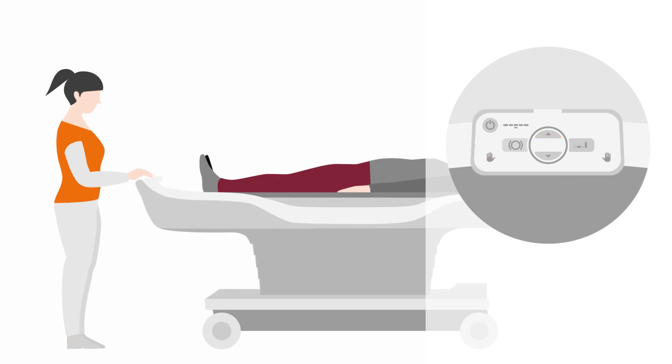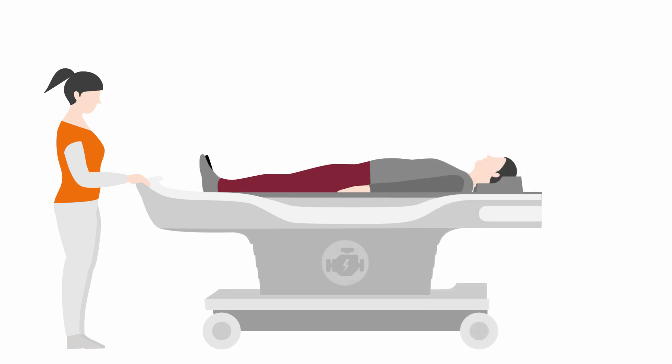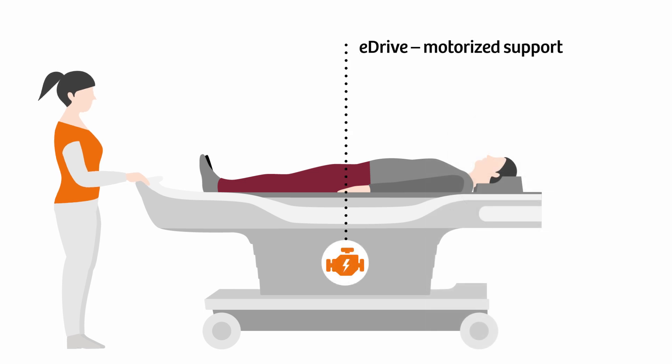The table is sensitive to the user's touch and activates the eDrive motor support as soon as both hands are positioned on the handle for effortless patient transport.